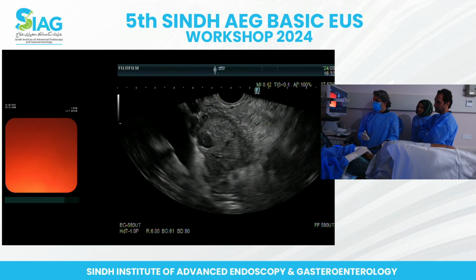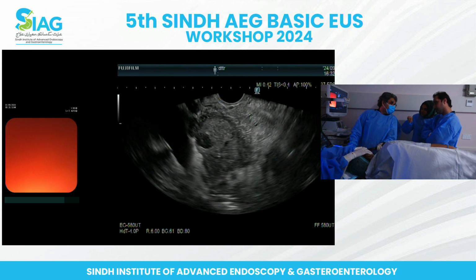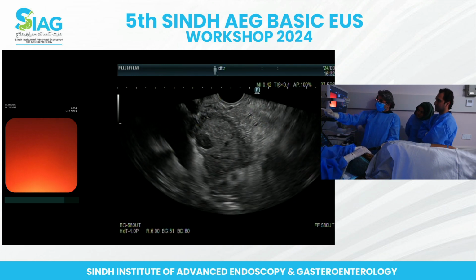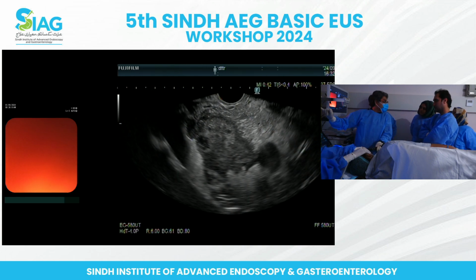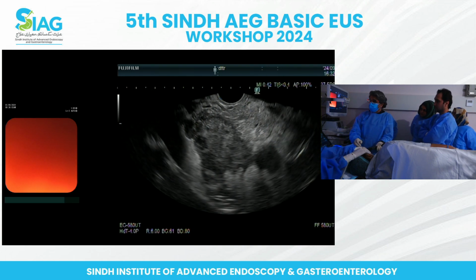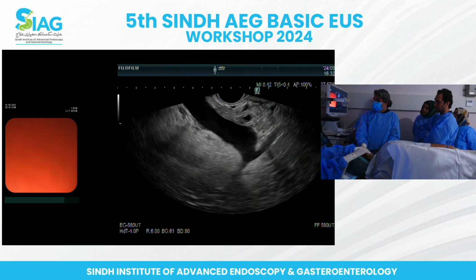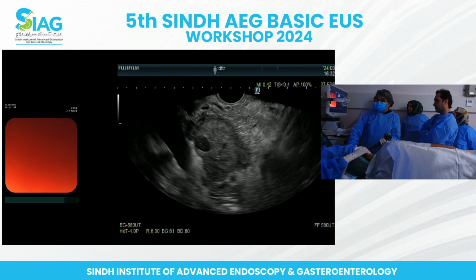So, yeah. You'll be able to see whether the vessel is actually going to be involved. What you see here is right, the portal vein. I think, or actually at this point, I can't really say, I think this is abutting the portal vein. I definitely think it is.